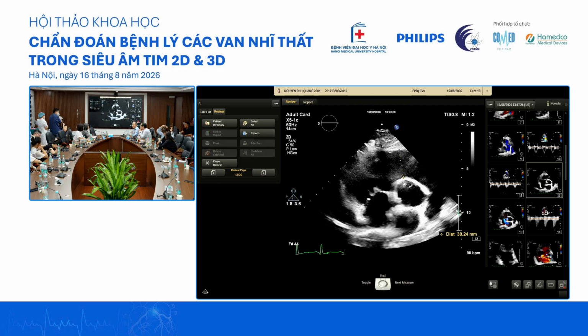But the 2D parameters, your TAPSE otherwise, and fractional area shortening 45%. So I think there's evidence for RV remodeling, dilation, reduced RV function on 3D echo assessment. I was looking very hard for the ECG changes, but I do not get even the minor criteria for ARVC. The tricuspid regurgitation looks central, so I think it's ventricular functional.